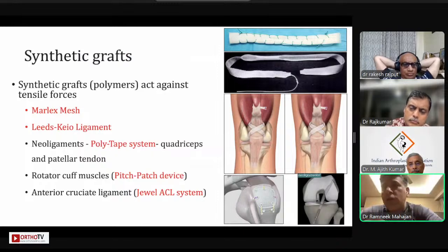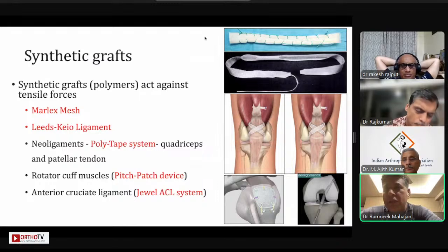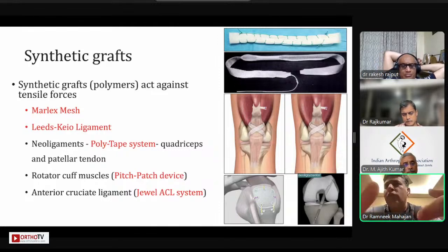The best part was that the strength of this material is so good that I realize there is no point in me protecting them. And we've had very excellent results in the short-term period itself. Now I think the first patient is nearly a year old. Flexion is never an issue because this always happens in 2-3 months. At 2-3 months, they've already achieved whatever flexion they had.